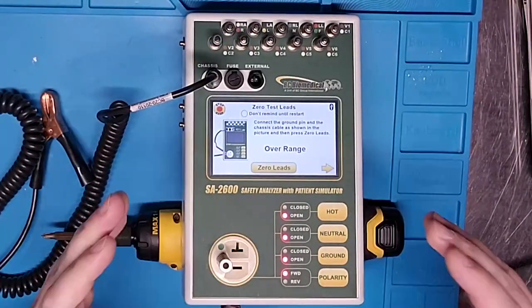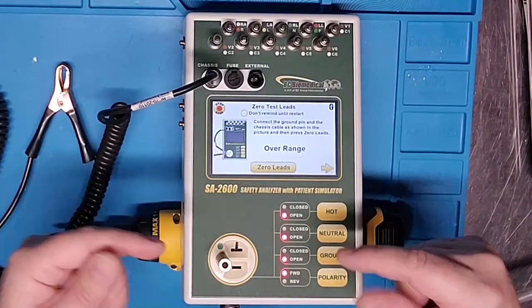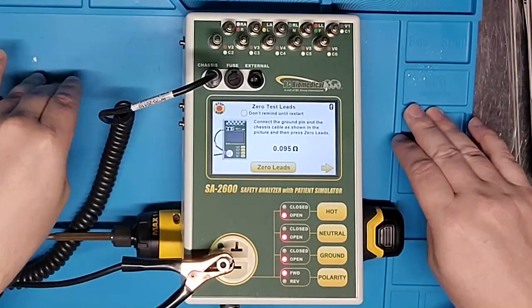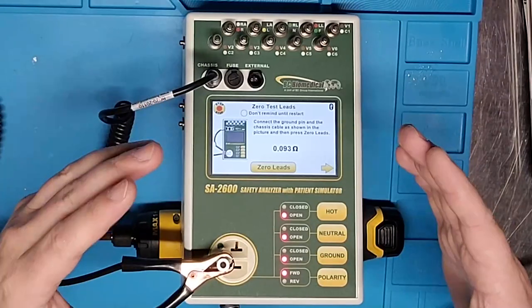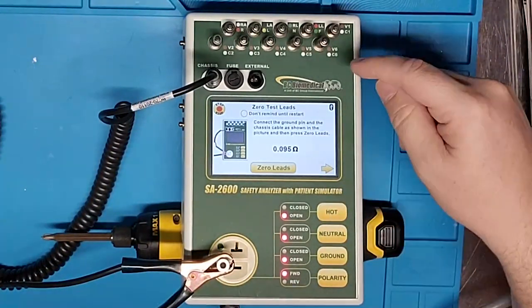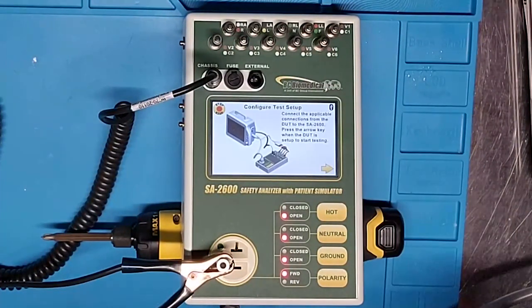One of the first things it prompts you to do is zero your test leads — you should always do this, especially when powering up for the first time. It actually has a picture on the side showing you which port to connect to and what you need to do to zero the test leads. That's the intuitiveness I was talking about — don't make me guess, don't make me look up a video or flip through a user manual in the field. Storage is cheap; more manufacturers should include pictures like this.